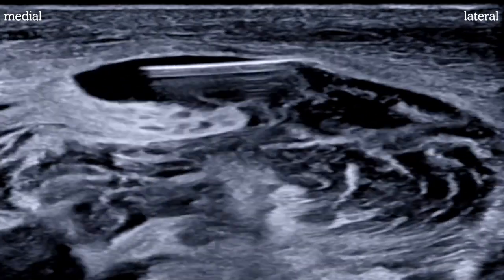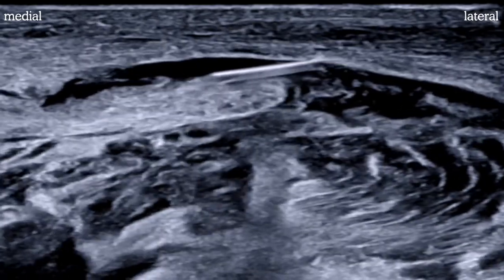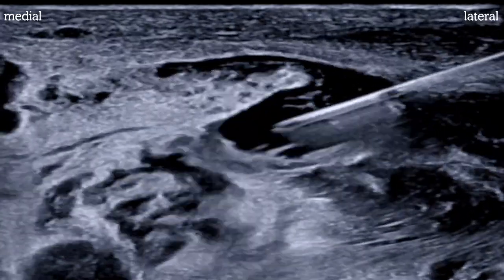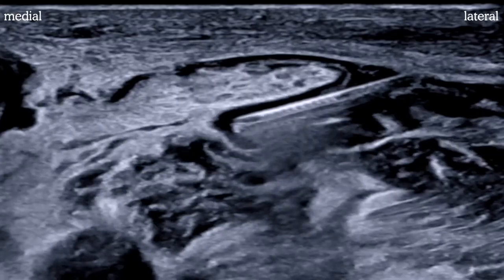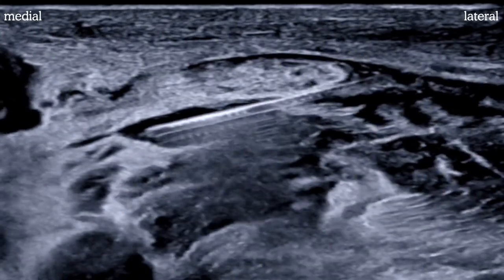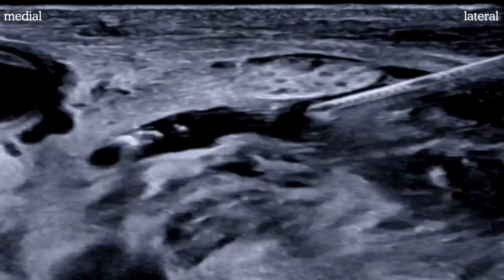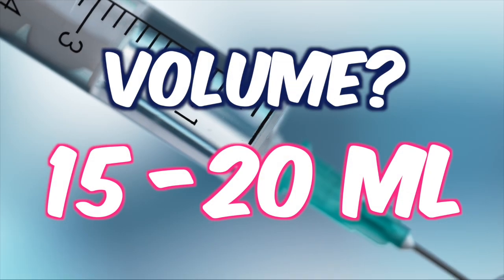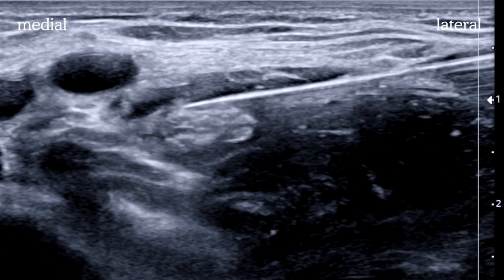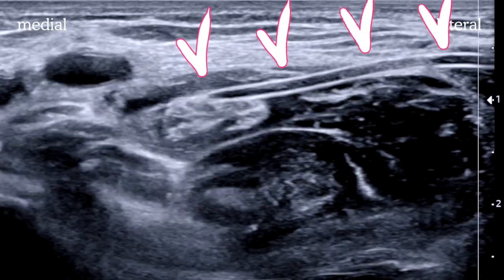We're being careful not to touch the nerve with the sharp tip. That is more than enough coverage to get a good block, but sometimes if the planes are amenable, we'll peel the nerve off the muscle with some local as well, which will hasten the onset. That nerve is swimming in local. For a single shot block, 15 mils is usually plenty — you rarely need more than 20. The femoral catheter technique is done in much the same way: expand the space, then leave three to five centimeters of catheter there.